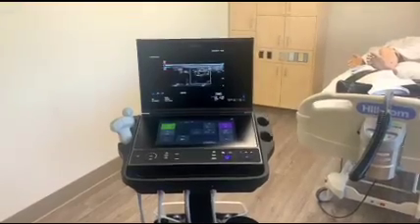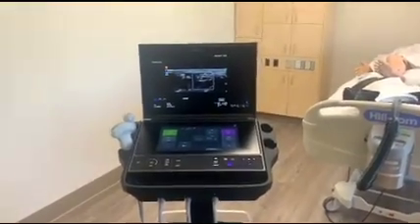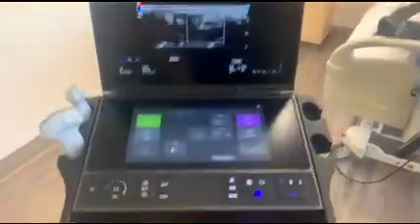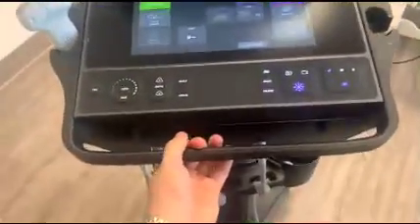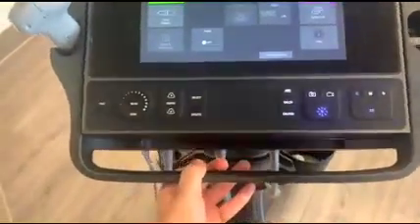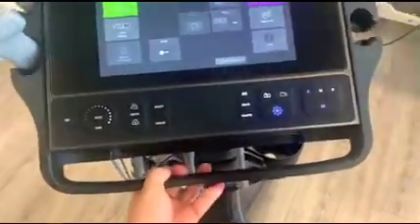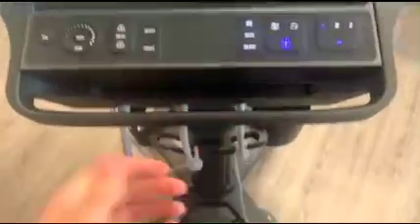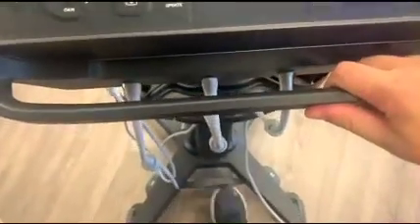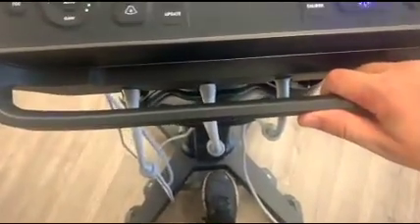You can adjust the screen in a few different ways. You can tilt it right here, or if you want to raise or lower it, you can press right here.